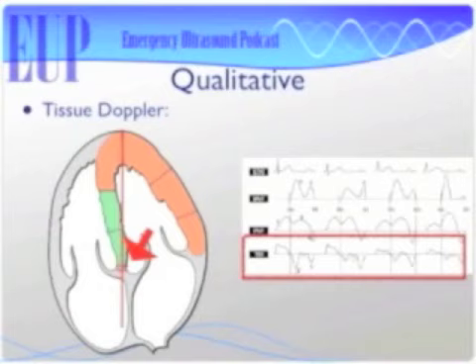So now what am I measuring? I'm measuring the speed of tissue. I'm measuring how fast does that tissue descend during diastole. So it's basically telling me how compliant is my ventricle. That's exactly what it's telling me. The faster my E prime wave is, the faster the tissue's moving and the more compliant that ventricle is. The slower my E prime wave is, the slower that ventricle is relaxing and the tougher that muscle tissue is, and the more diastolic dysfunction.